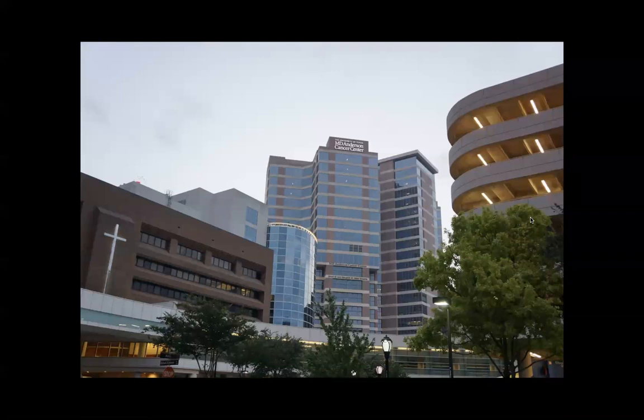So I have used, during my experience in the very beginning, a lot of pancolonic dye-based chromoendoscopy, and I would recommend that to every endoscopist in the beginning of his or her career to create better mental representations of the flat adenomas, to understand how they grow and how to remove them completely, how to inject, to visualize them better, to remove them better. It comes a moment when we become confident we may not need to use dye-based chromoendoscopy routinely.